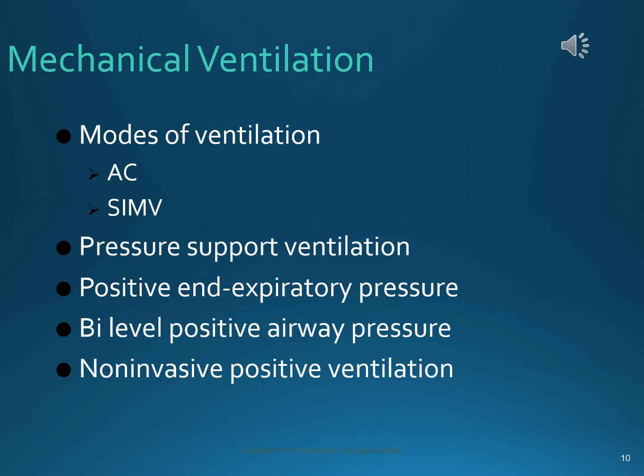CPAP is something that we'll talk about in a lecture on obstructive sleep apnea. It's continuous positive airway pressure on inspiration and expiration. It's just continuous pressure, and it keeps the alveoli open in a spontaneously breathing patient. This does nothing to breathe for the patient.